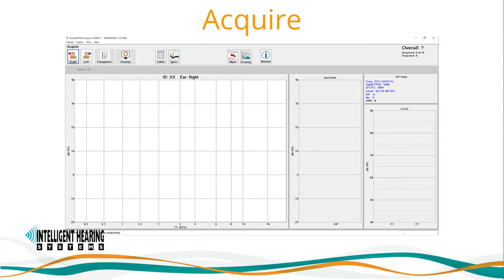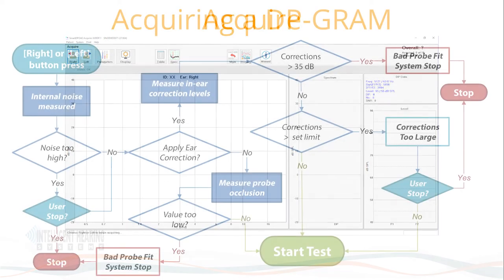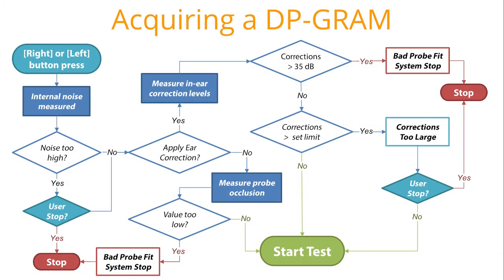Begin testing by selecting the Acquire screen and choosing the right or left Test Ear button depending on the ear the probe is placed in. But before we initiate a test, let's review the general testing procedure in DPoAE.